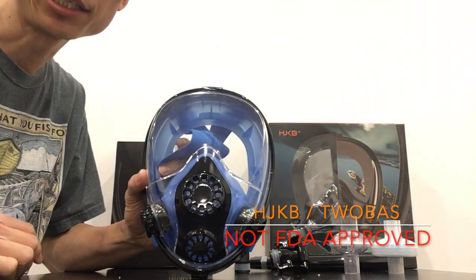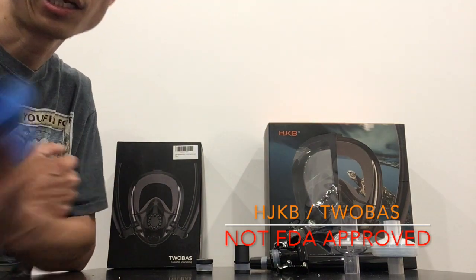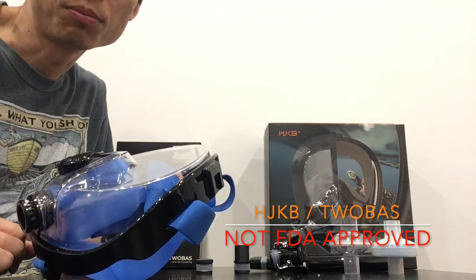This is a video explaining how to take your HJKB mask, or TWOBAS mask, and convert it into a PPE.